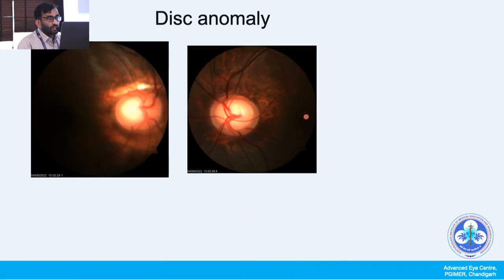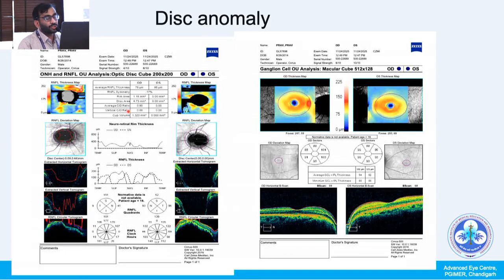Here is a patient who came just last week, managed as glaucoma, but on carefully seeing, the disc changes were symmetrical. This is more of a disc anomaly rather than glaucoma, and the OCT is funny, with poor segmentation and unidentifiable structures, but the GCC is relatively good and the thickness is all within normal limits. The patient was followed without medication because of the symmetrical changes, and the patient had already had an epidermal cyst excision, this kind of congenital anomaly. So be careful, correlate everything together, and do not label the disease glaucoma just by seeing the OCT.